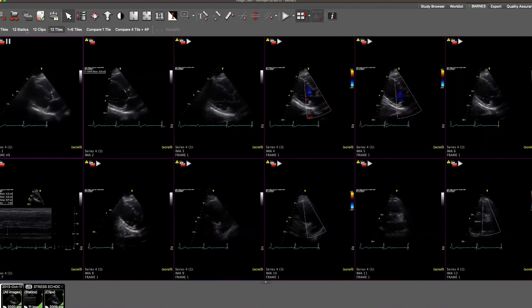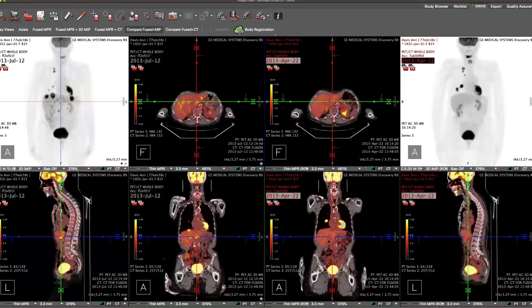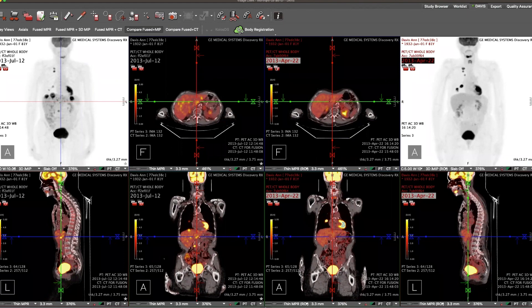Now we'll move on to the next study on our list. Here we have a PET CT, side by side, current on the left in white text. The red text represents the prior study. Note the backlit date so that you can easily see the prior study's date.